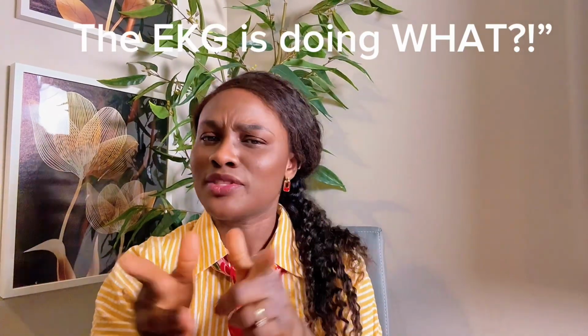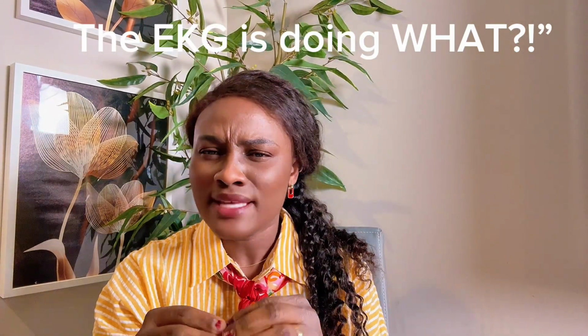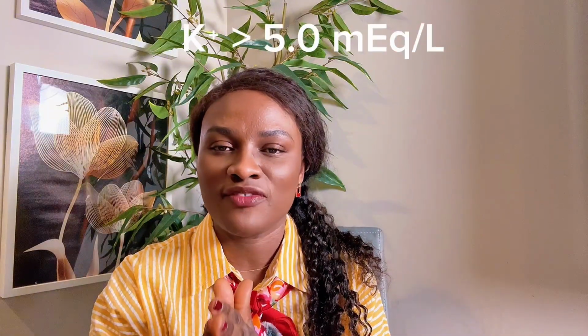Hi guys, now tell me, have you ever looked at a rhythm strip or a telestrip and seen a wide, bizarre complex staring back at you? Well, hyperkalemia might be the culprit. Let's break it down very fast here. What hyperkalemia is all about, okay? So basically, hyperkalemia is when your serum potassium level is above 5 milliequivalent per liter.